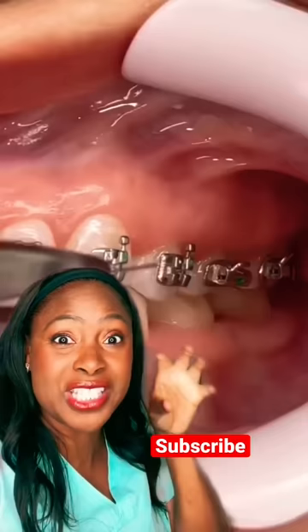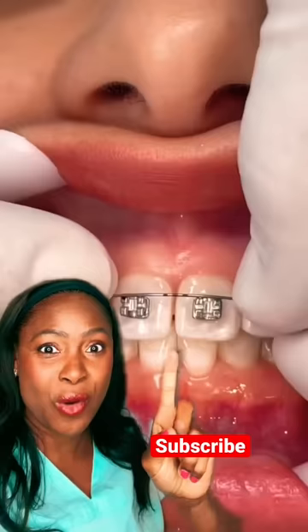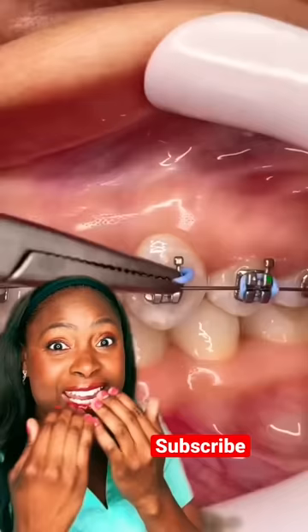Here comes the wire — you can see the wire going in. This person got to choose their braces color, and they went with a great choice. That's going to make their teeth look whiter and even better.